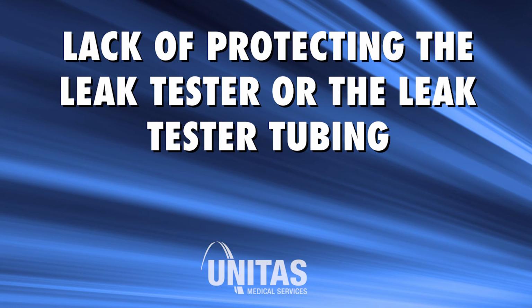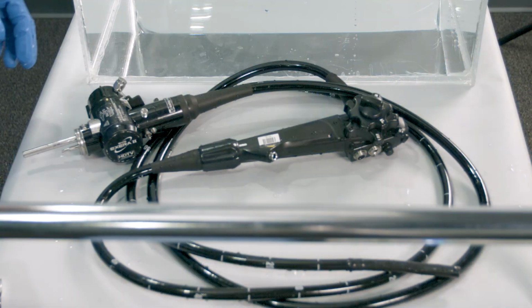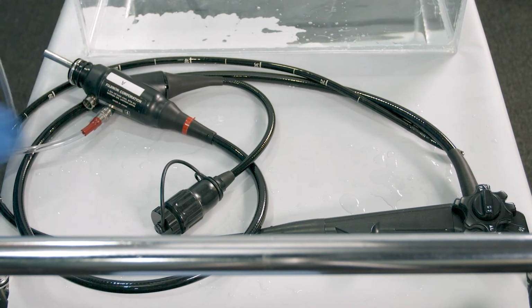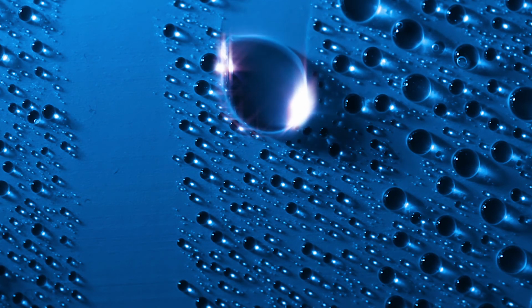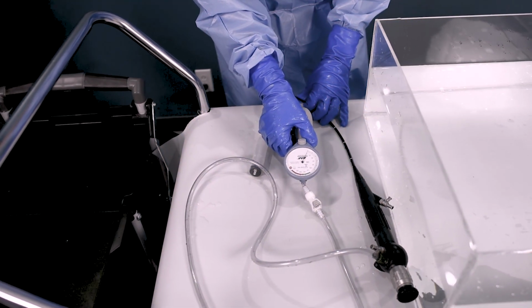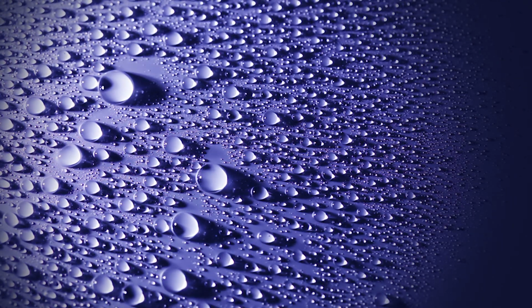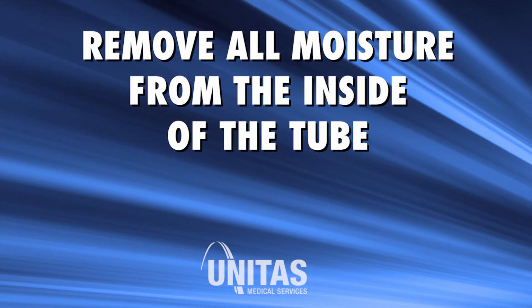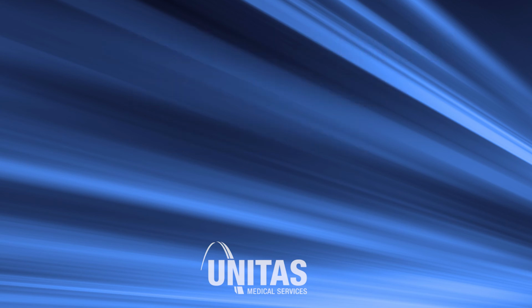Lack of protecting the leak tester or the leak tester tubing. All leak test tubing, regardless of leak tester type, needs special care to not get fluid inside the tubing or tubing connector. Fluid inside these areas, if not removed, will cause water to be blown into the endoscope on the next test. If using a handheld leak tester, it will be very important to not allow the leak tester body, the tubing, or both to fall into the fluid. This will result in fluid invasion. If the end of the tubing accidentally falls into the sink, make sure to blow out or run the tester air until all moisture is removed and the tubing is internally dry.